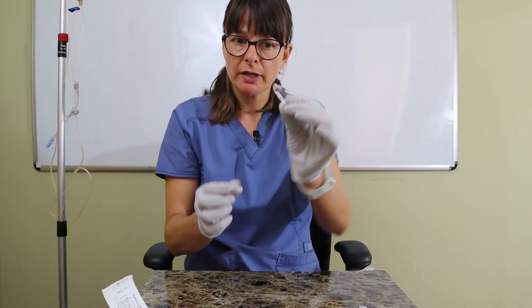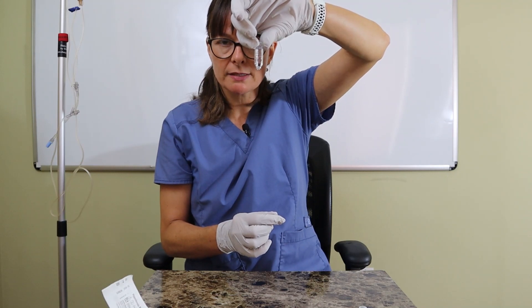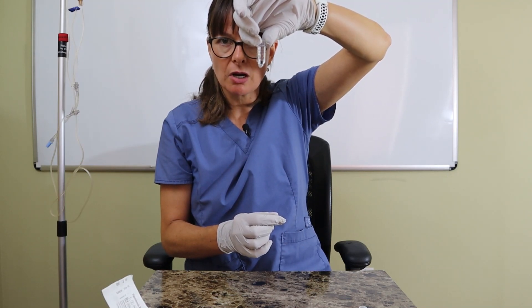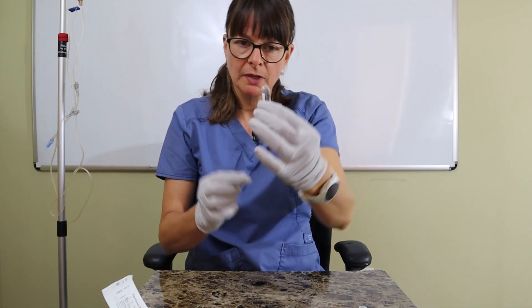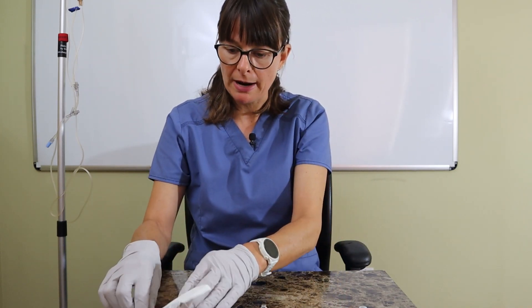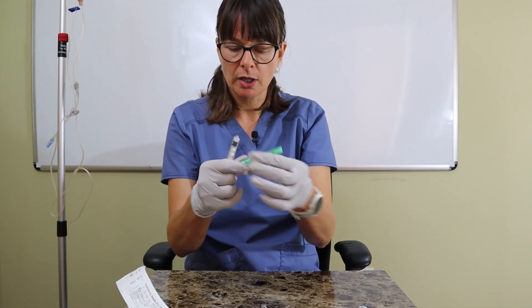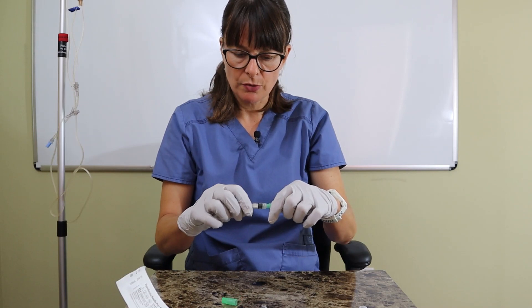A very interesting phenomenon: I can turn the ampoule upside down and nothing will drip out because of surface tension. Keep that in mind — however, once I put a needle in there it might drip out. So I'm going to attach the filter straw to my syringe.